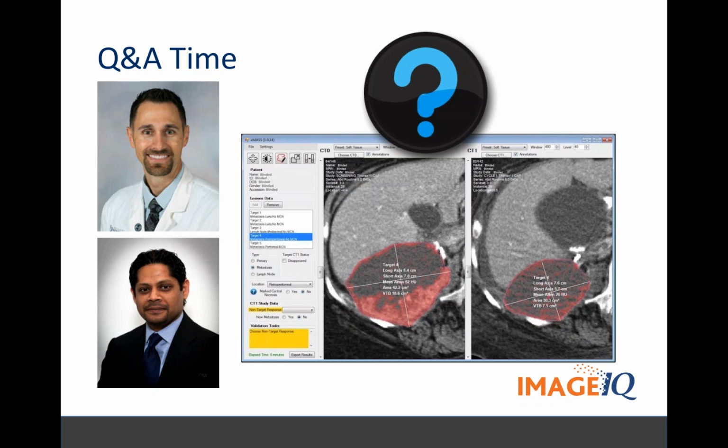So we are in the process, along with a number of other companies, to develop software that automatically detects these tumors in 3D. And we've done a few studies where your longest axis on a 3D tumor can be off by 300% or more compared to the long axis made in a 2D measurement on an orthogonal plane.